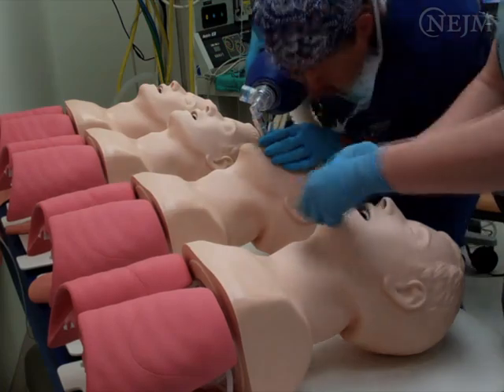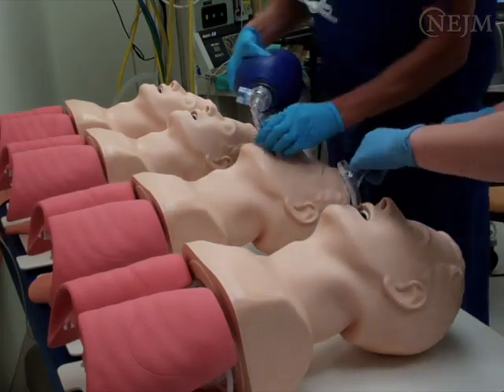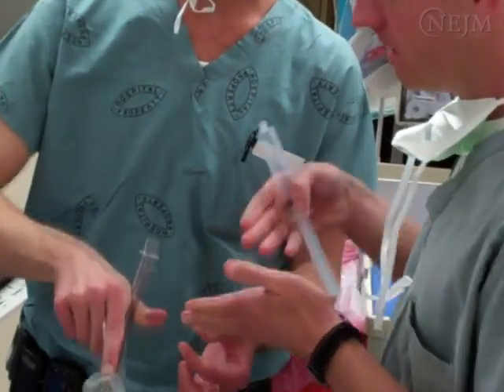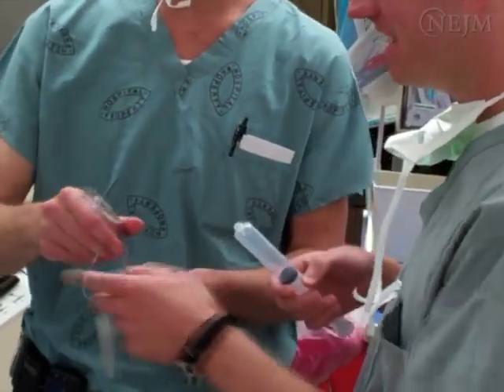Instruction beyond this video is necessary for safe and effective placement of a laryngeal mask airway, and the clinician should seek further training from anesthesiologists or others who have expertise in its use.